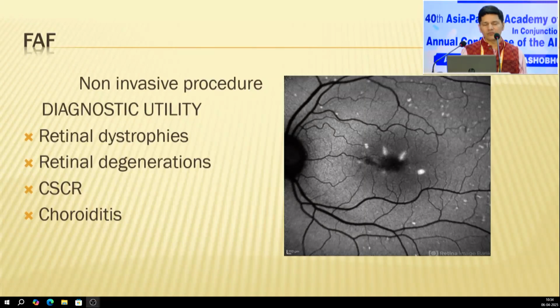Then this is a non-invasive procedure, and it is of very useful value in certain conditions like retinal dystrophies and retinal degenerations, CSR, and choroiditis. And this instrument makes use of your lipofuscin pigment, and can make out many useful diagnoses which cannot be diagnosed with other equipment.